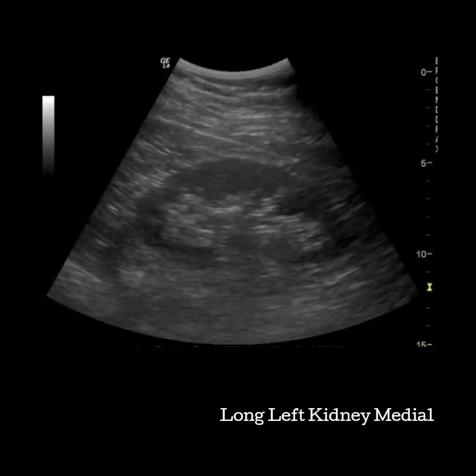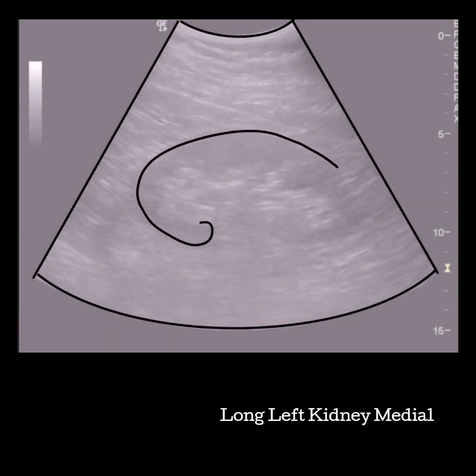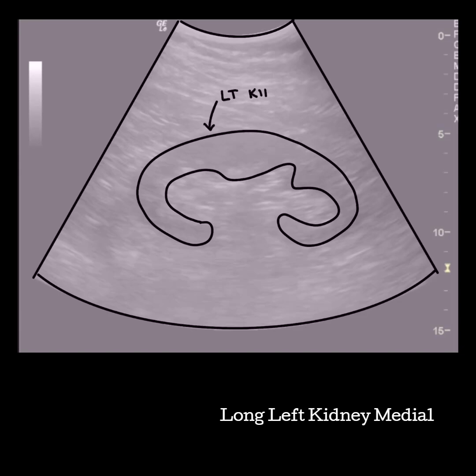The last picture in long is at the medial plane. Bring the beam towards you watching for the cortex to break away at the hilum. Watching for the hilum to become visible is the best way to recognize the medial slice. The left kidney is often visualized in a coronal plane so you'll see the hilum on the deep side of the kidney. Be careful how you're coming at the kidney — you can sometimes make the kidney look mal-rotated when you have the patient rolled.